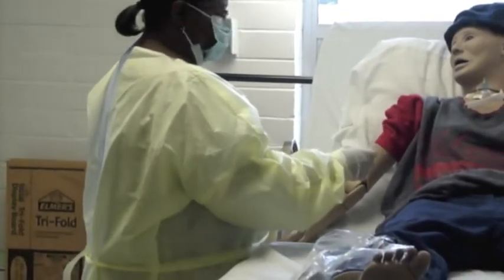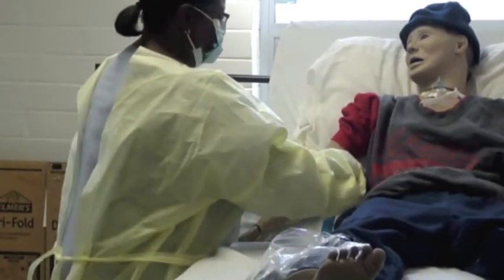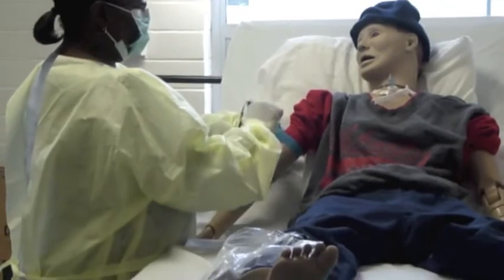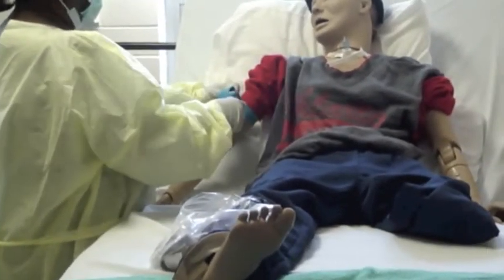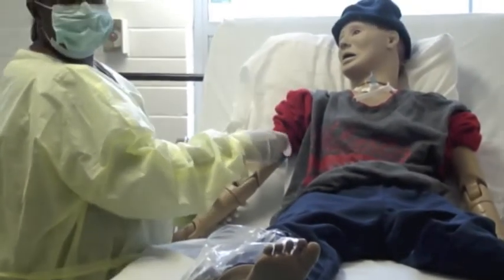I don't need to. I'm just going to start with the alcohol now, okay? So if that's the case, I don't have a sterile tourniquet. So I'm going to put this tourniquet on, but I'm not going to put it on as tight. But I'm going to still have it tight enough so I can get the blood flow. You understand what I mean by that? Okay.